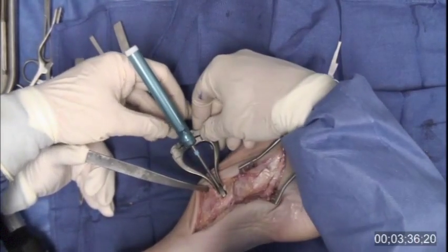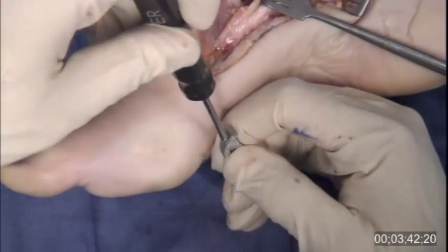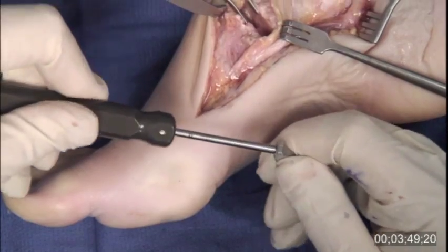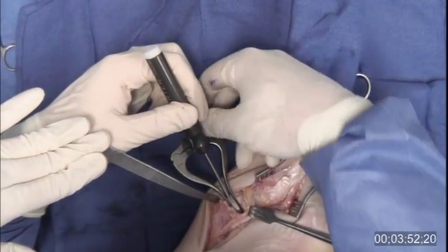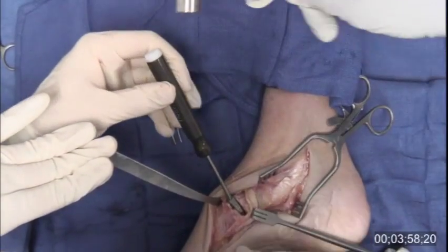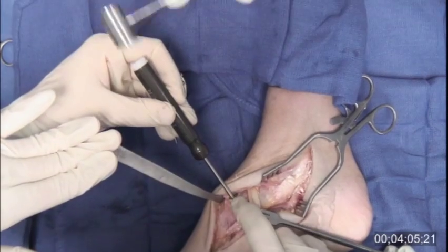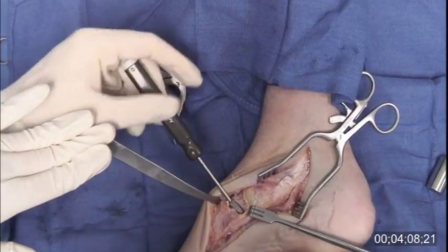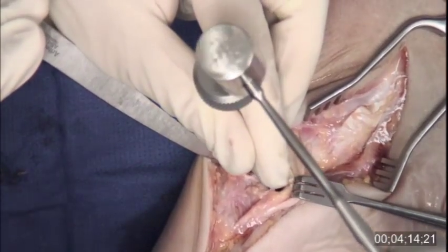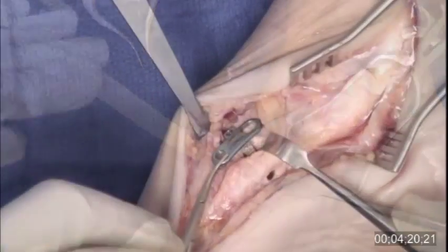The porous BioSync wedge allows for improved bony ingrowth with enhanced resistance to abrasion compared to competitors. As with the Evans wedge, the central fenestration may be filled with bone graft. The threaded inserter facilitates wedge placement, which is fine-tuned with an impactor. Typically I allow patients to bear weight in a cast boot at two weeks with a medial displacement calcaneal osteotomy or a cotton osteotomy. After a lateral column lengthening procedure, weight bearing commences at four weeks. While the BioSync cotton wedge is indicated for use with plate fixation, I typically do not find this necessary in my practice.